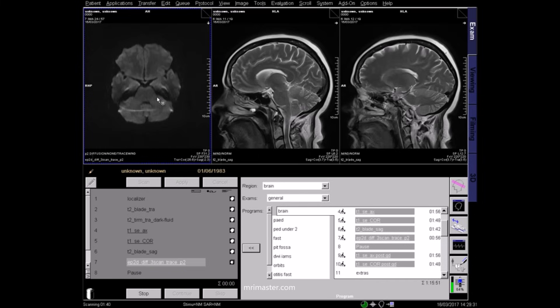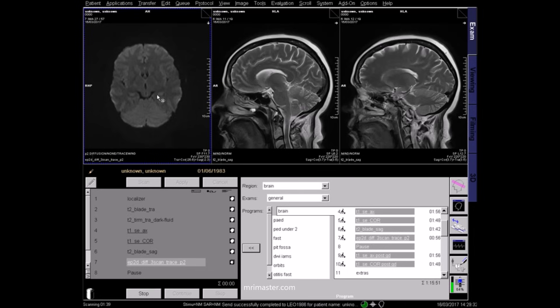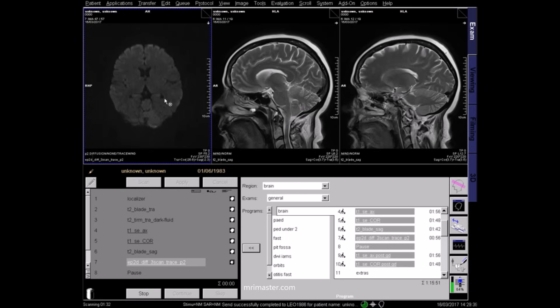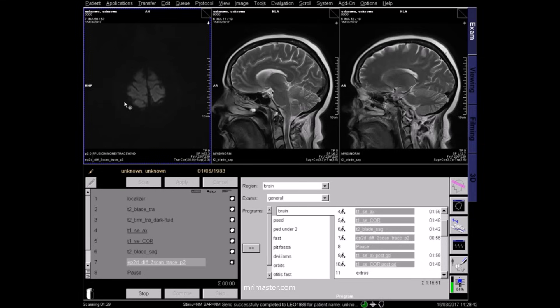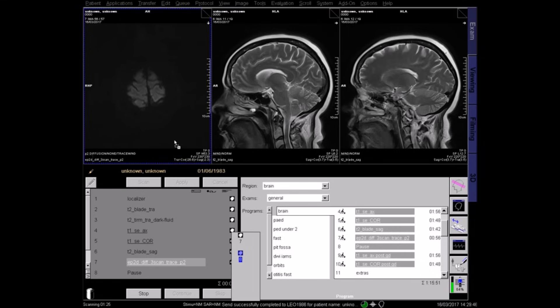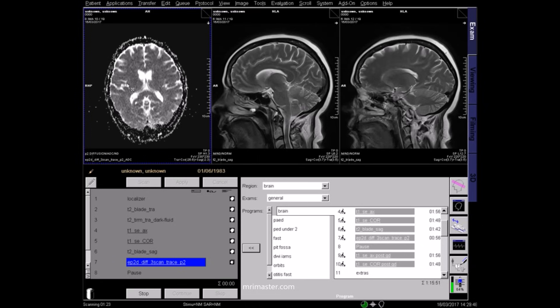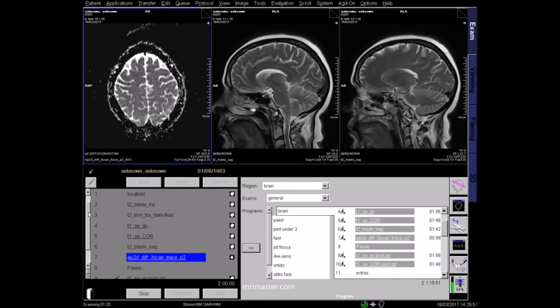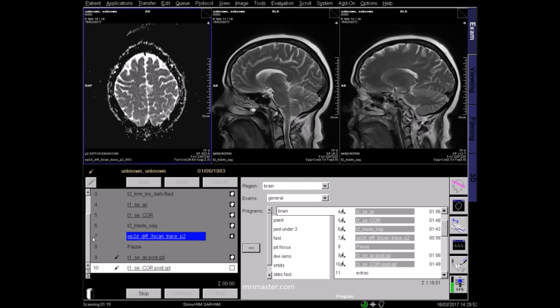This is a B500 diffusion sequence. And this is a B1000 sequence with a high diffusion factor. Here, areas of restricted diffusion, such as stroke, will appear bright. This is an ADC, or apparent diffusion coefficient map, where areas of restricted diffusion now appear dark.